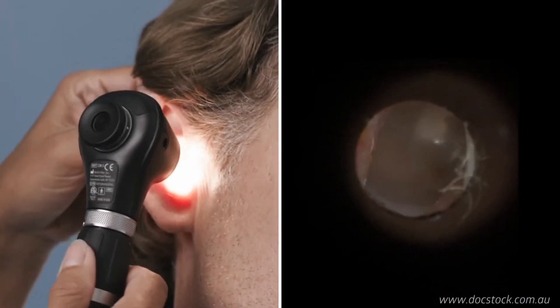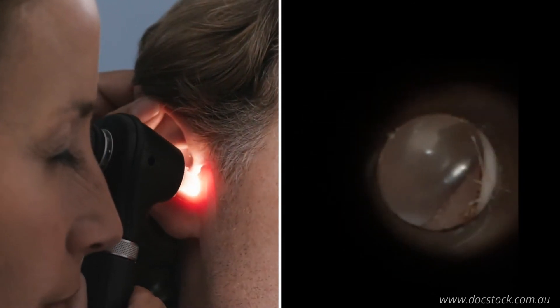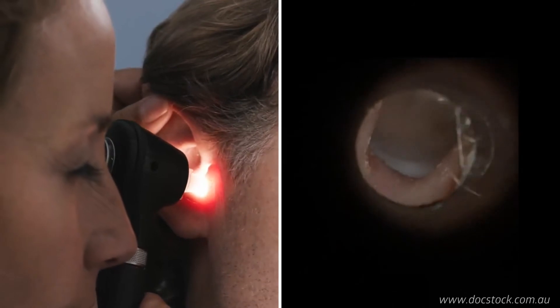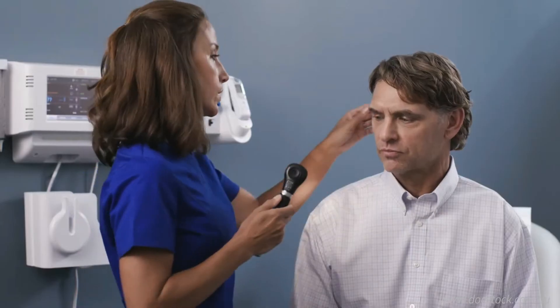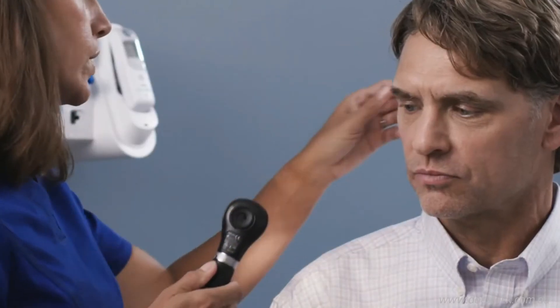It's best practice to examine the healthy ear first. This allows you to see the patient's normal ear anatomy and compare the other ear while helping to prevent the spread of infection. Straighten the outer ear canal to make insertion of the speculum easier. For adults, retract the pinna upwards and backwards.